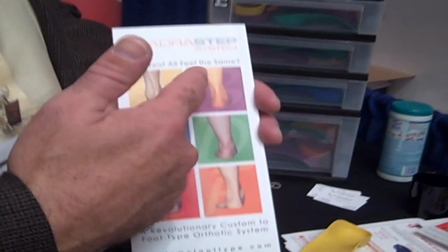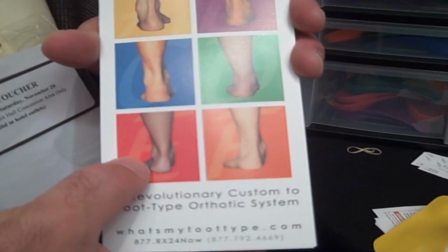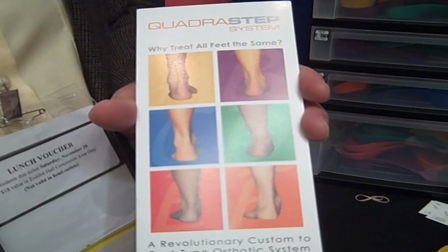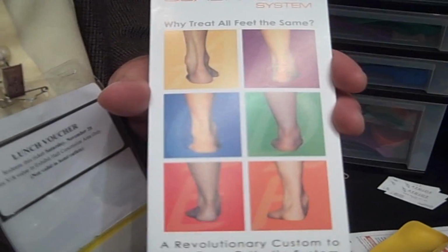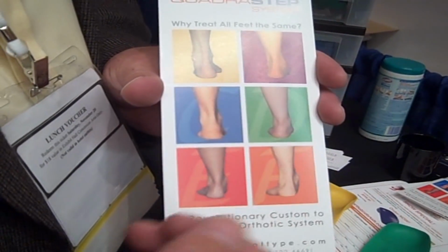So for example, I have 6 options here. My feet on the right here have really hypermobile flat feet, and my feet on the left have more hypomobile fuller arches. So the first thing I identify is I look at, is the arch high or low? Well, I see this patient, for example, is a very flat arch. I think my feet on the right because their heels evert.